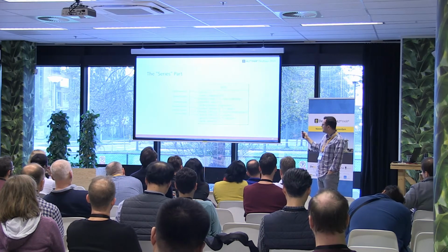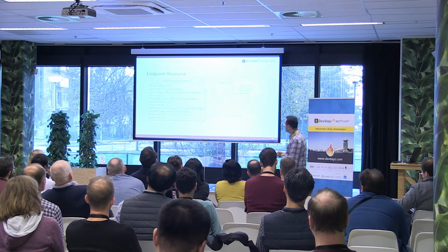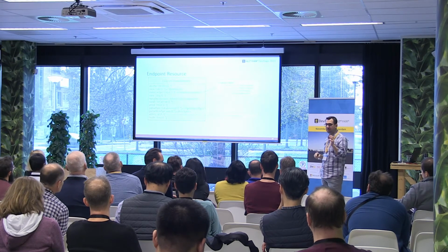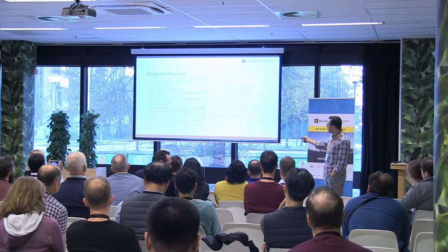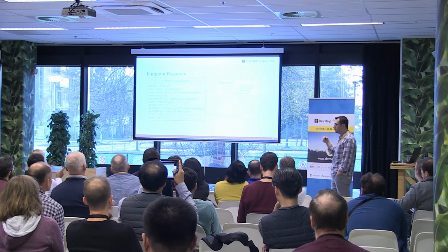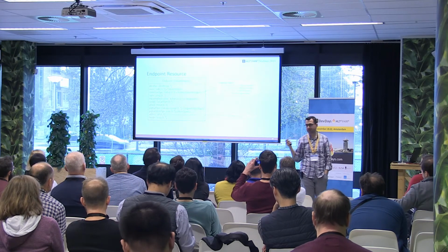I'll skim over the series because we're actually running late, but similar idea, attributes that correlate one way or another. I'll skim over the instance. Endpoint is the one we want to see. So the endpoints, you can have as many as you want of these in an imaging study resource, and you can have as many as you want pointing to different things. So if it says DICOM WADO URI, then this is a way for you to retrieve that study. Now that's the classic way, meaning it's the older standard.